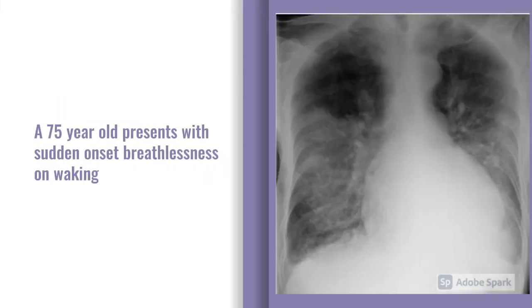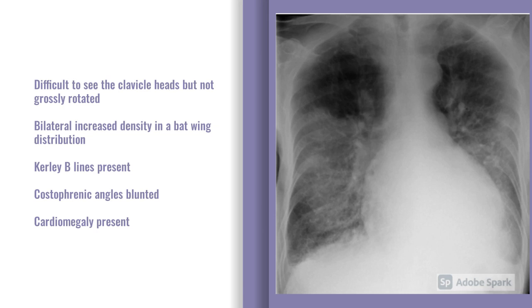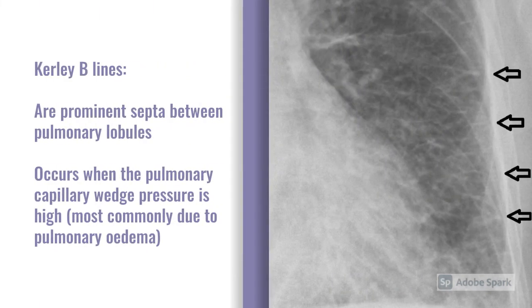Next: a 75-year-old who presents with sudden onset breathlessness after waking up. It's difficult to see the clavicle heads and the vertebrae through the heart, so exposure isn't ideal. Airways: the trachea is nice and central. Breathing-wise, there's increased density in the mid and lower zones in what we would describe as a bat-wing distribution, and there are some Kerley B lines present. The costophrenic angles are both blunted. On C, there's cardiomegaly — the heart appears large and bulky. The diagnosis is pulmonary oedema. Kerley B lines are prominent markings between the pulmonary lobules — the alveoli, ducts, and sacs — present when you have a high capillary wedge pressure, commonly seen in pulmonary oedema.